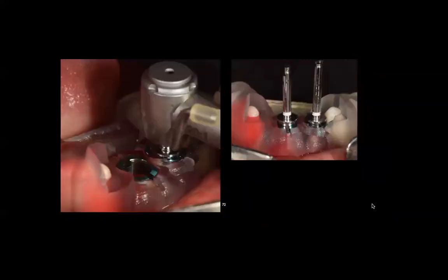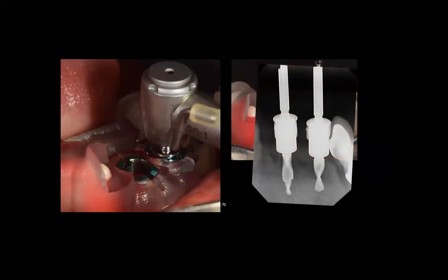So in this particular case, I'm pretty sure that this is what we want. I go to the measurement with the 2 millimeter burr, and I just go ahead and put it in. Now, another thing that I like to do, I like to take an x-ray with those burrs inside.